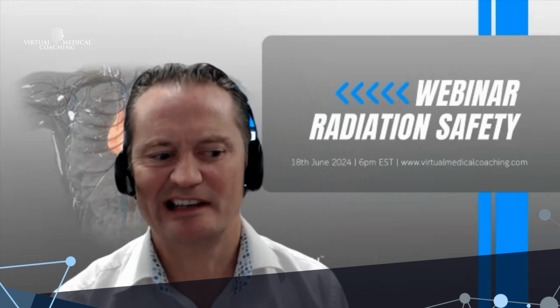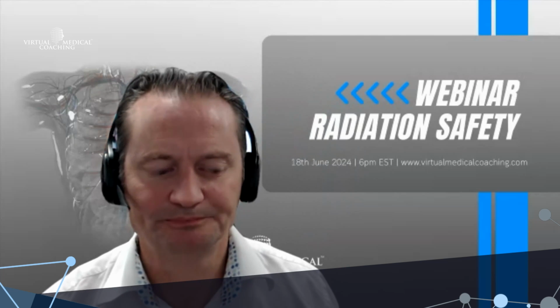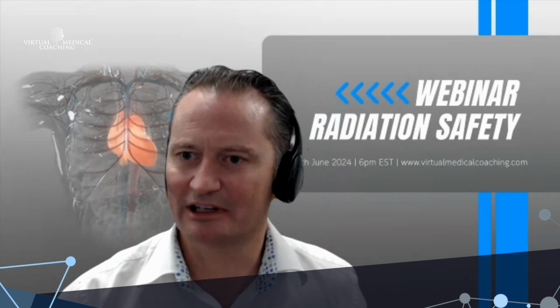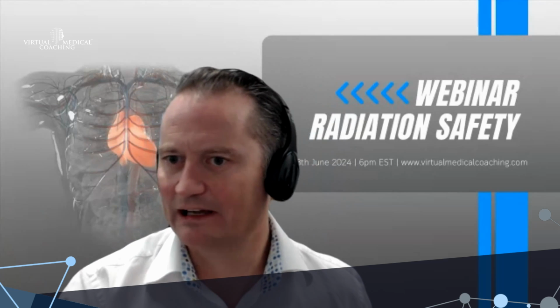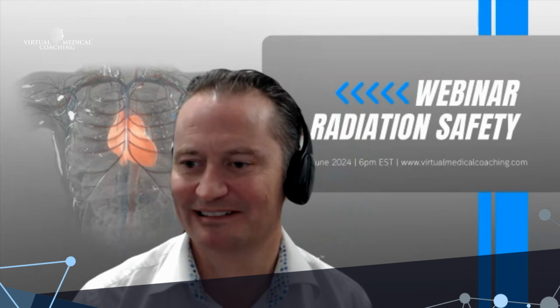Even if you are standing behind someone, because we can move our people around the room, as you'd imagine, you can put a variety of staff members, say the cardiologist at the front, then maybe the anesthetist behind them, and then a radiographer. They're obviously getting a lower dose, but it's not zero, whereas what we're looking for is this holy grail of a zero dose.